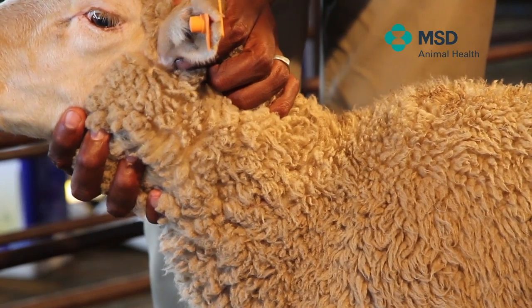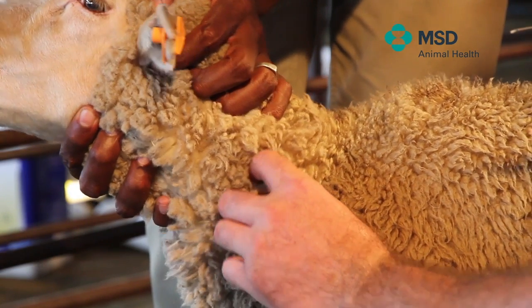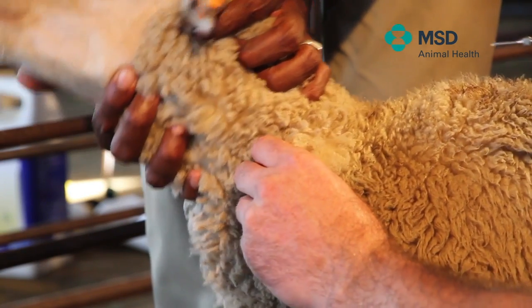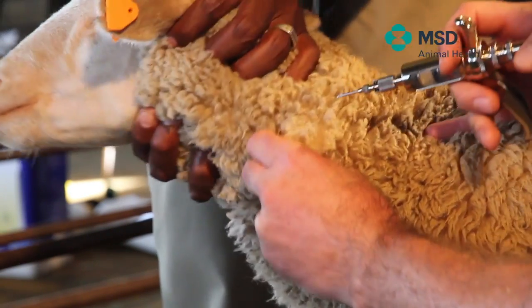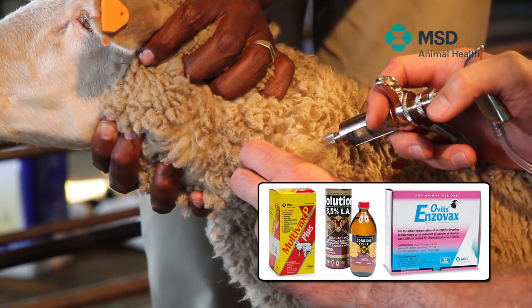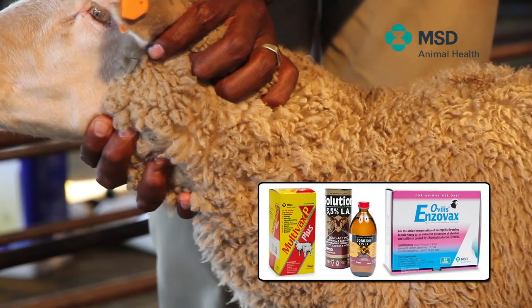For the subcutaneous injection, take the skin, pull it away and tent it, and at the base of the tent insert the needle, inject, and remove.